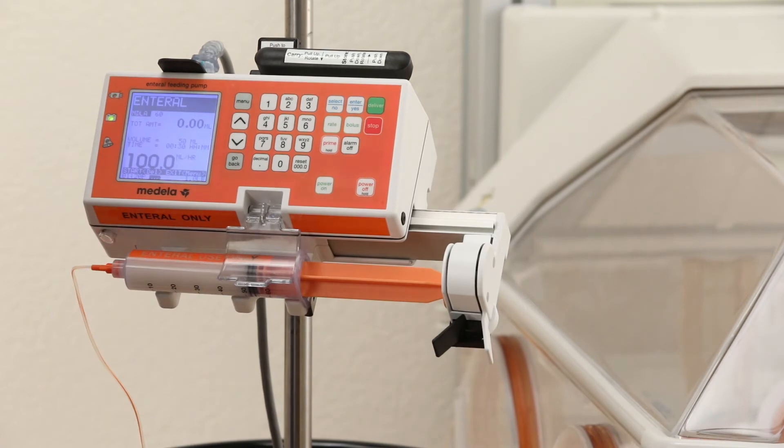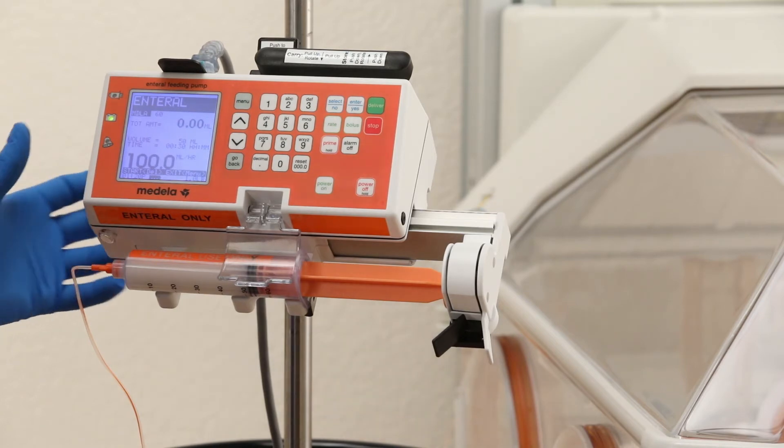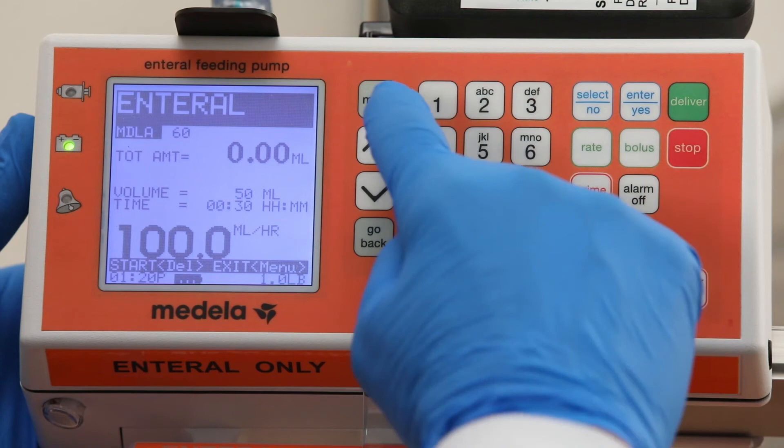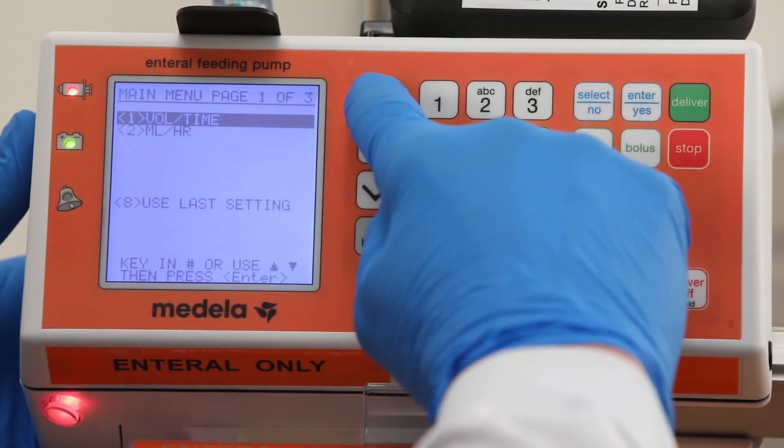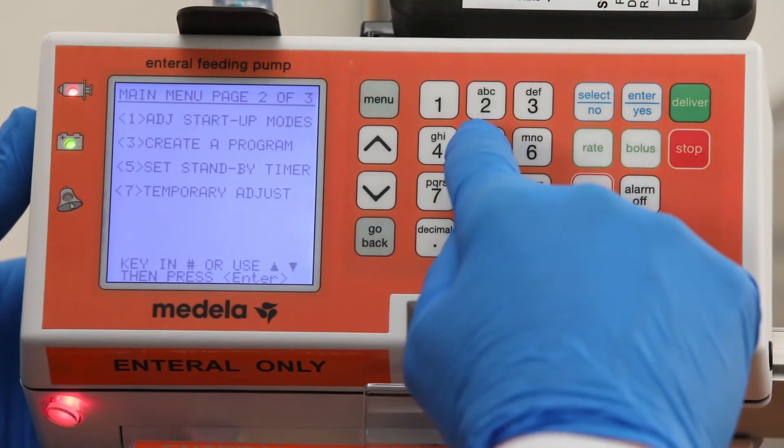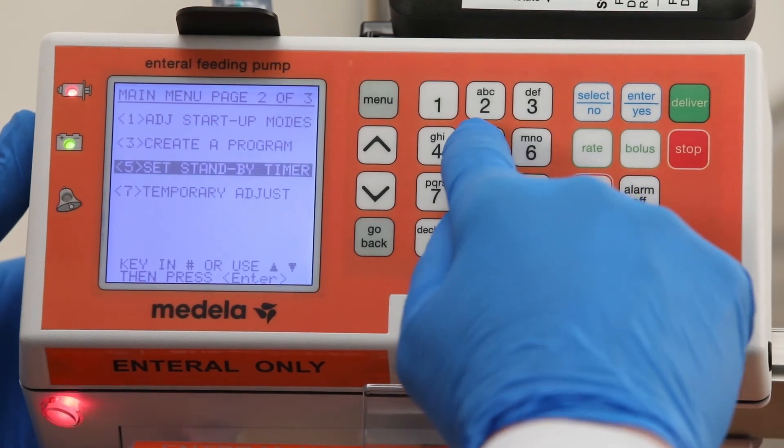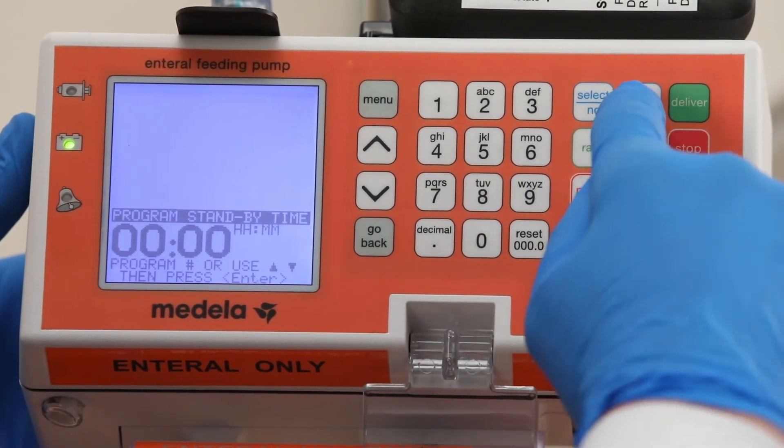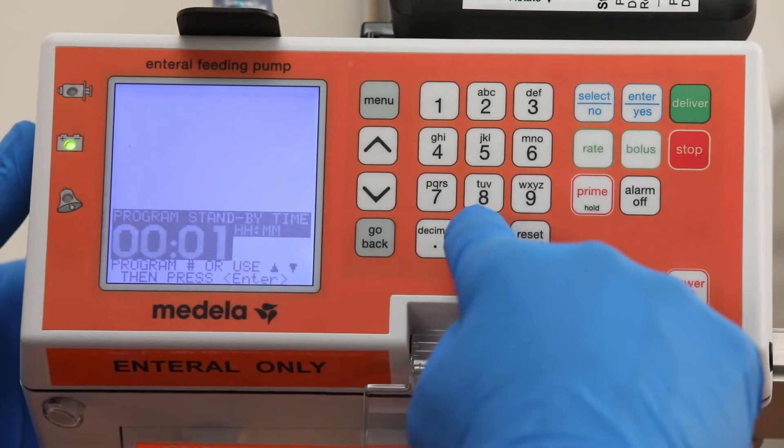The Medela Enteral Feeding Pump has a standby mode feature which allows a standby timer to be programmed with a time delay. The clinician is required to manually press start when the timer alerts. In order to set the standby timer, press the menu button twice after the feed is programmed and select option 5 to set the standby timer. Then program the desired time before you will be prompted to start the feed.